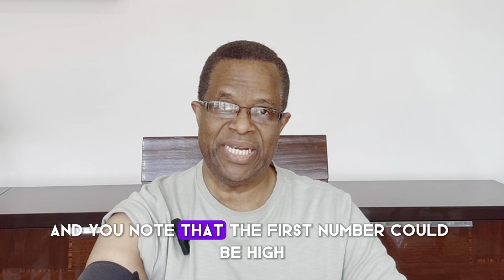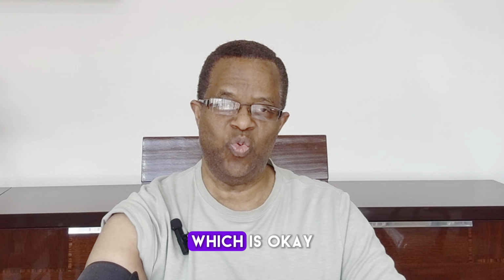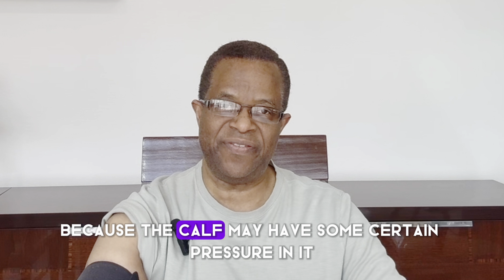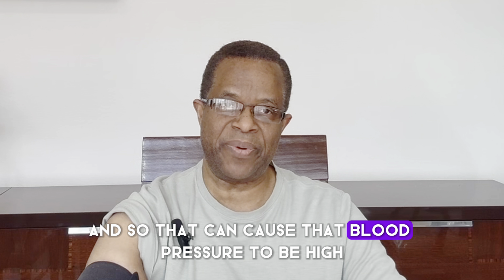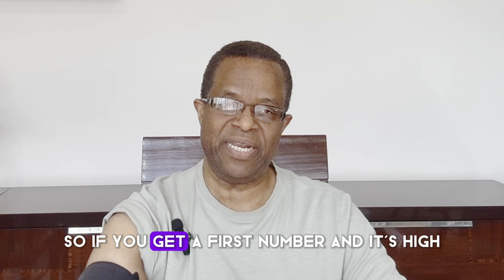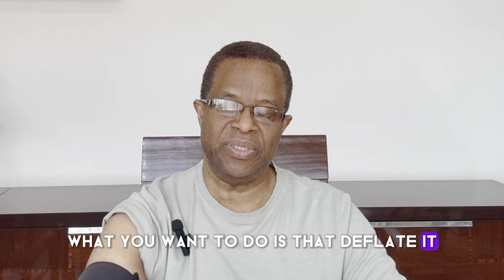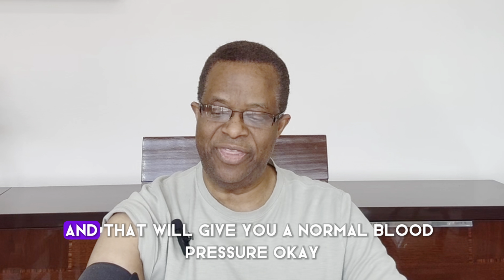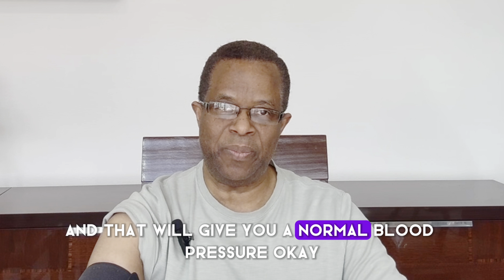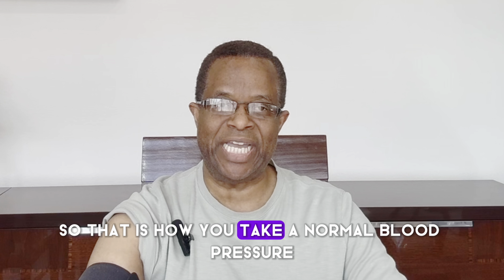So you sit quietly and you measure it, and you note that the first number could be high, which is okay because the cuff may have some pressure in it, and so that can cause that blood pressure to be high. So if you get a first number and it's high, what you want to do is deflate it, sit for about 2 minutes, and then retake it again. And that will give you a normal blood pressure. Okay, so that is how you take a normal blood pressure.